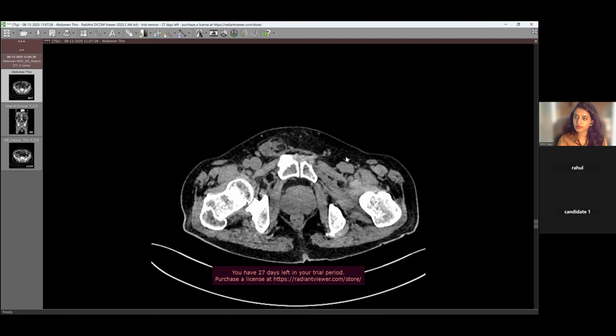And another thing I noted is, when you're doing that MR brain case, you were asking for multiple sequences like FLAIR, I want pre-contrast. So every time you say a sequence, you can follow it up by saying that I want to see if it is T1 hyperintense or hypointense, so that I want to rule out whether there's an intralesional fat or something. So you have to substantiate why you are asking.